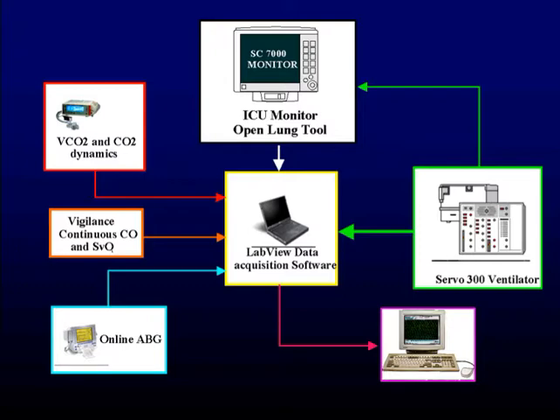Then we are validating the study of dynamic compliance by looking at the lung from different perspectives through all this dynamic process of recruitment, with the CO2 dynamics, what happens with the hemodynamics, and especially compared with what is considered now the best tool available to follow clinically the recruitment procedures, which is the online blood gas. Then we had a chance to integrate all this information in lab software on a laptop, and then have an offline analysis of our data.